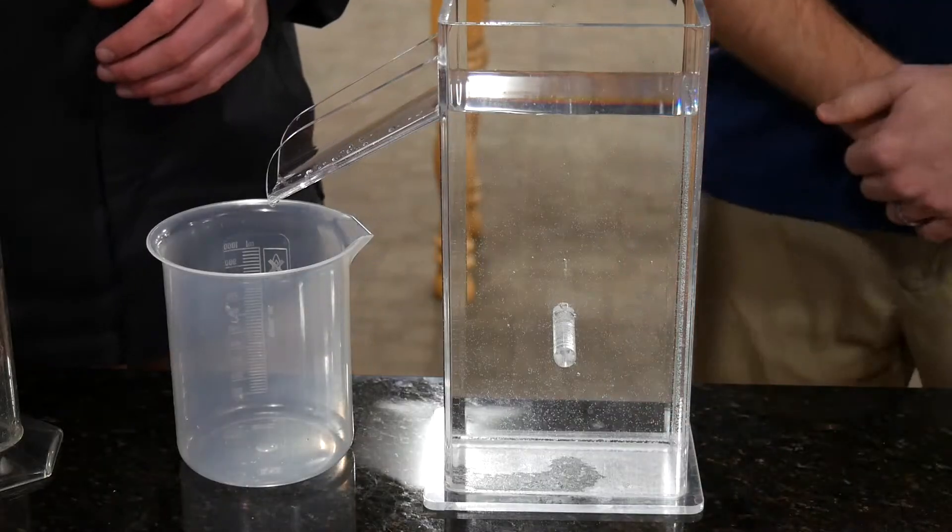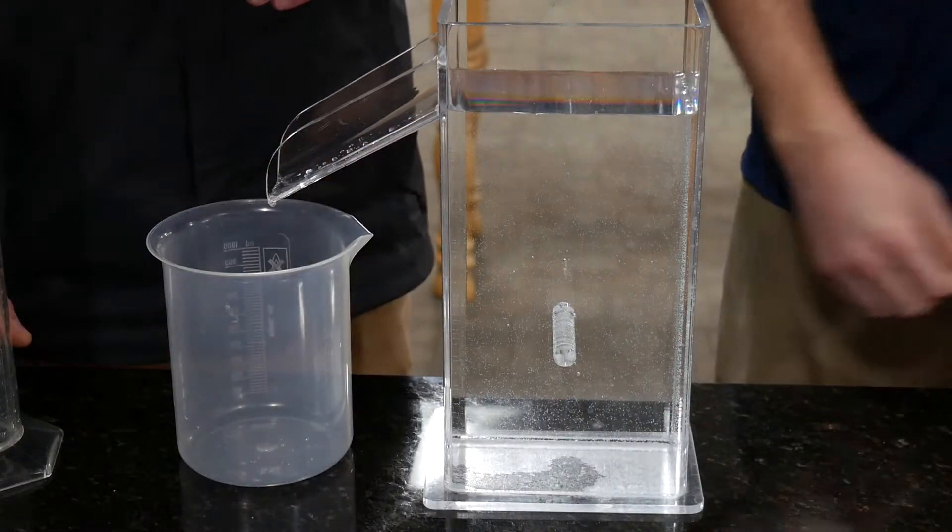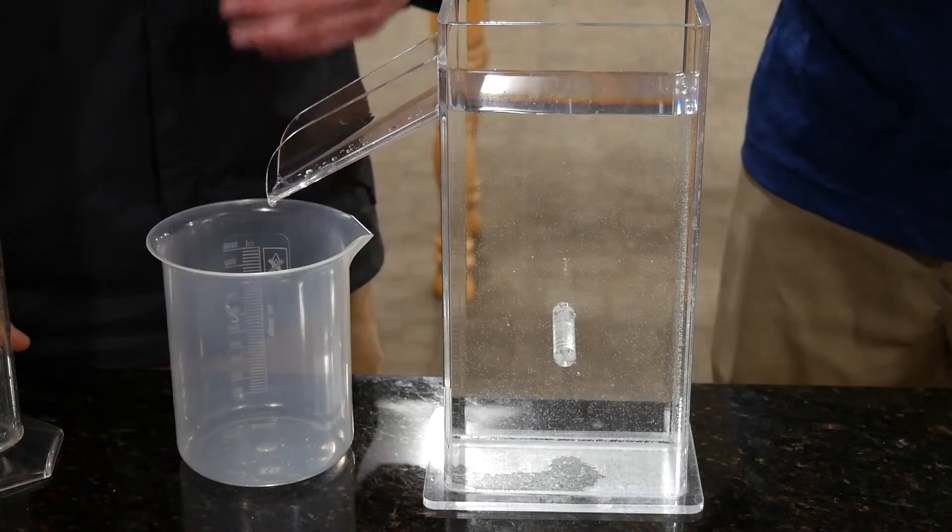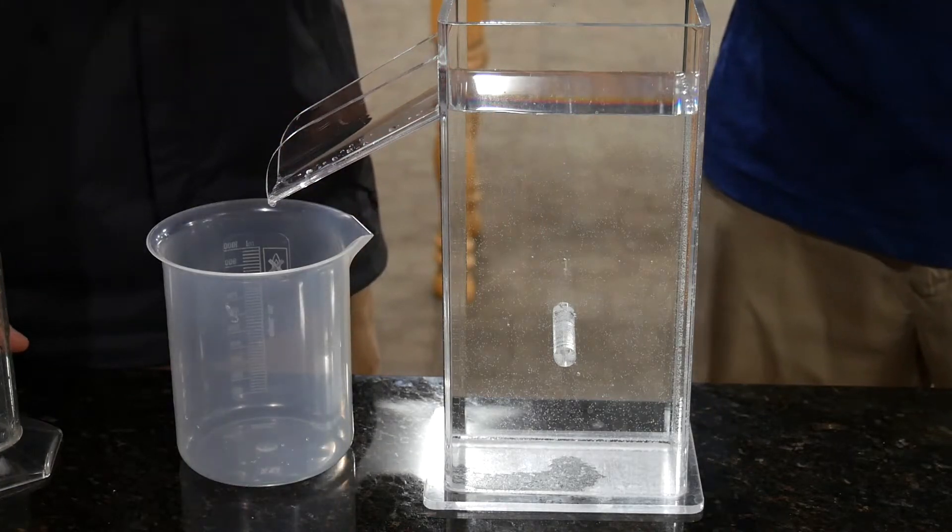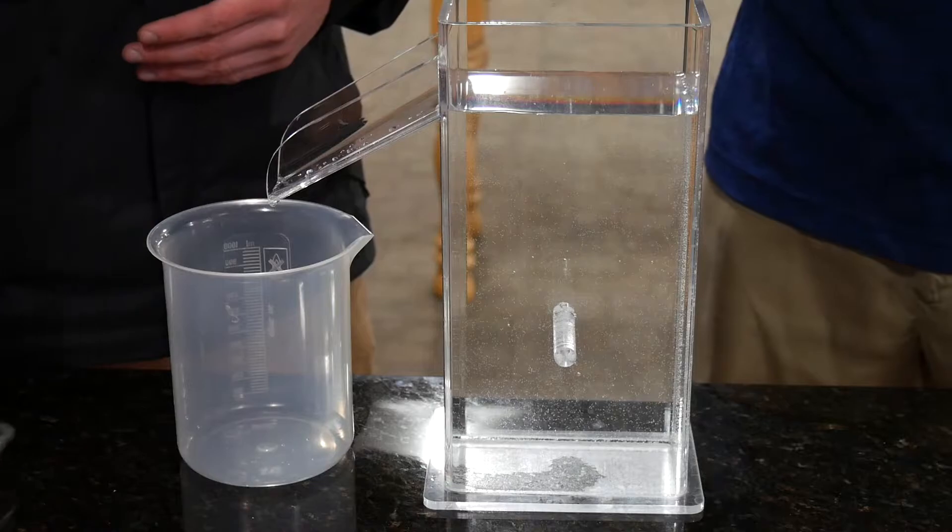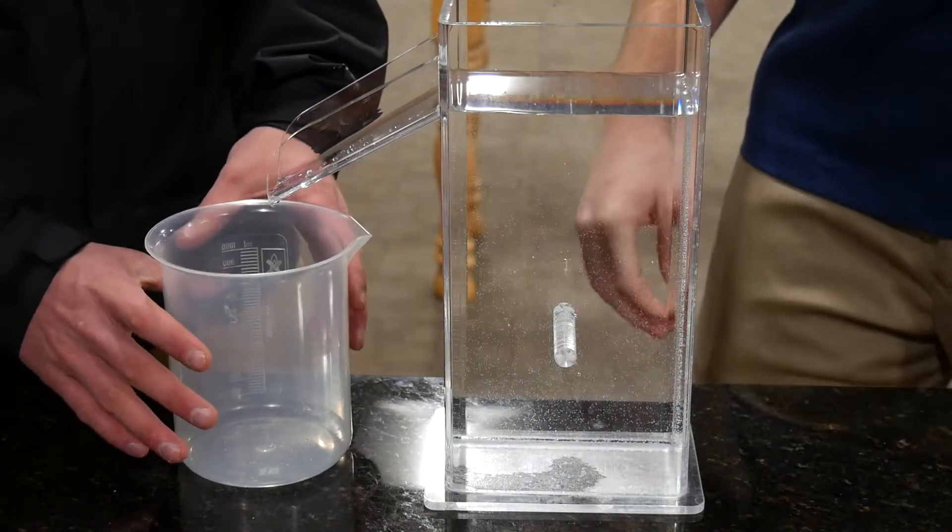So let's go to step two. Step two is patient instruction and hand placement in the volumeter. Parker here is going to be my patient and I'm going to instruct him as if he were my patient on how to place his hand in the volumeter as we collect the water to measure the edema in his hand.